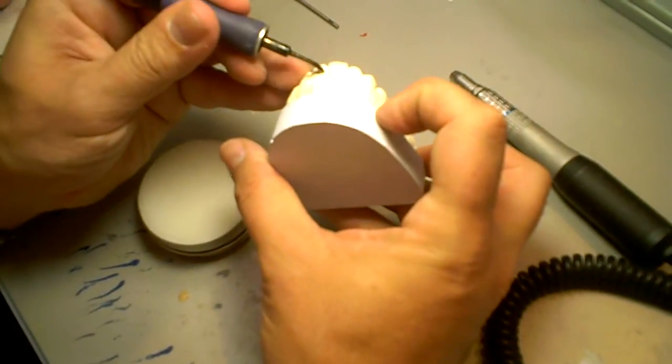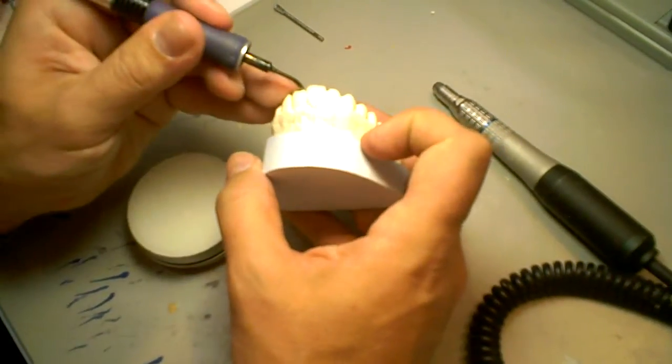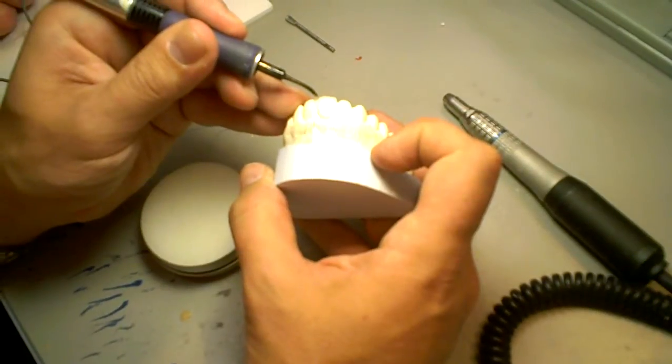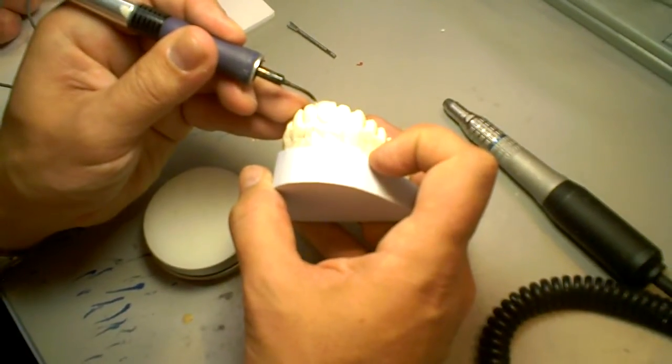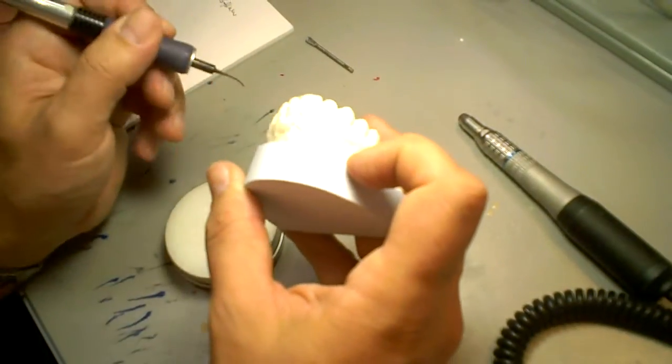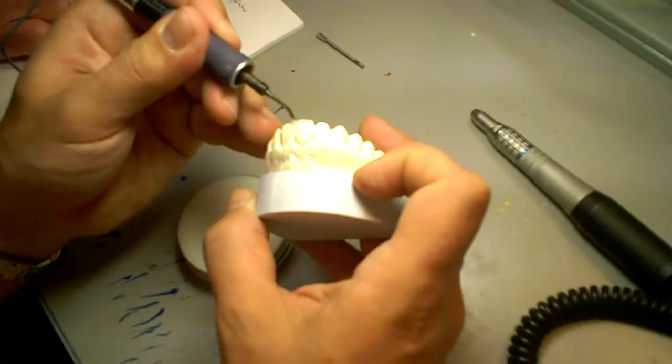So again, we're going to do the little case here. And what's going to happen to you, because you're not used to this waxer, is that the wax is just going to fly all over the place. Because you can blow on it and control it. And just like everything, it takes a little bit of practice.